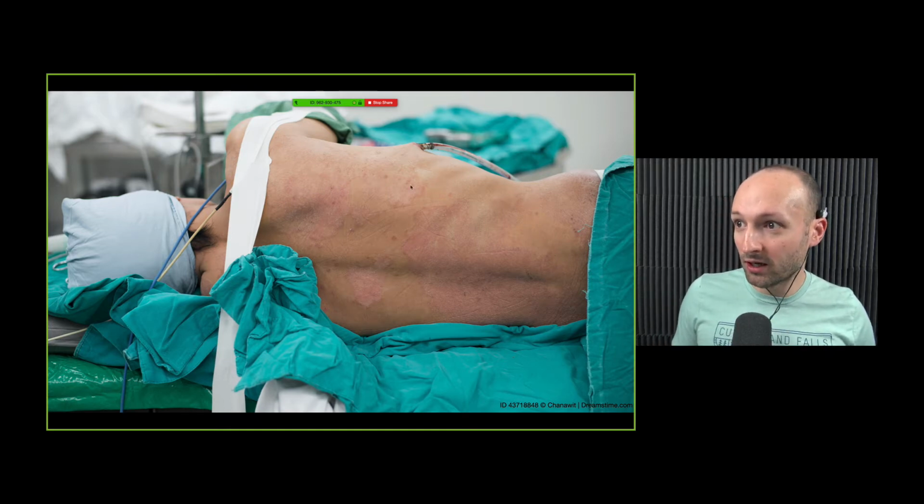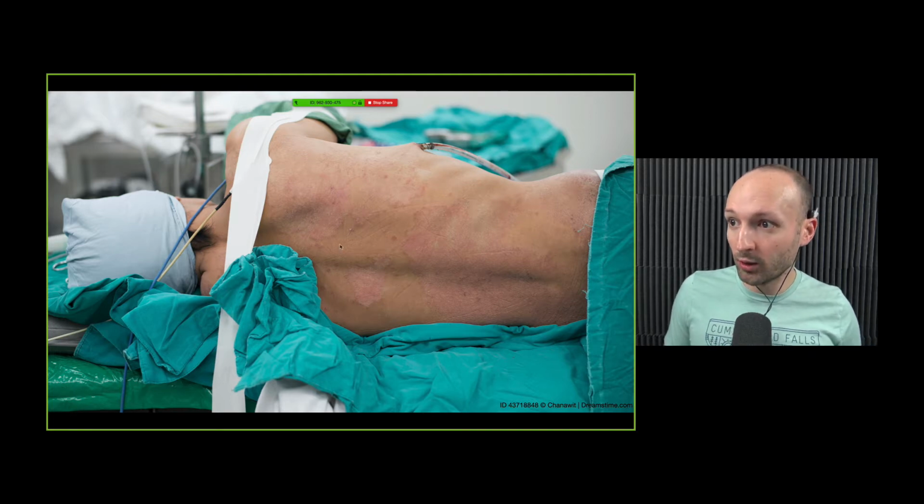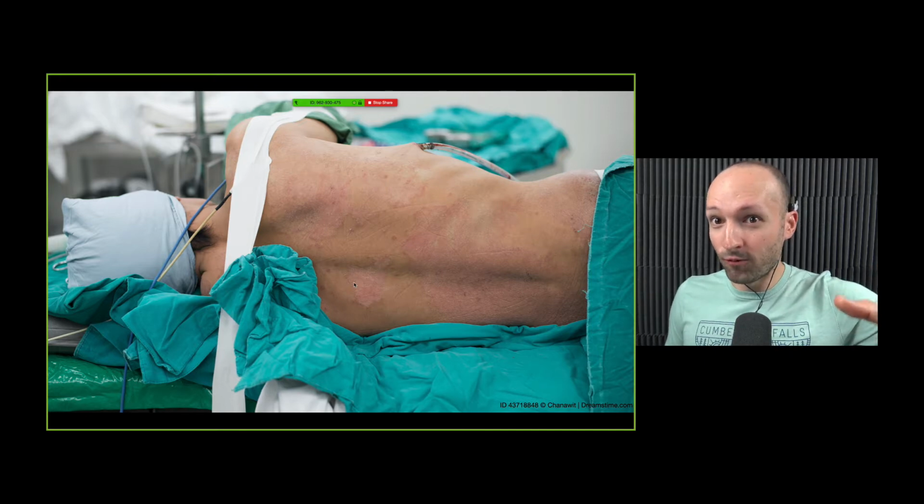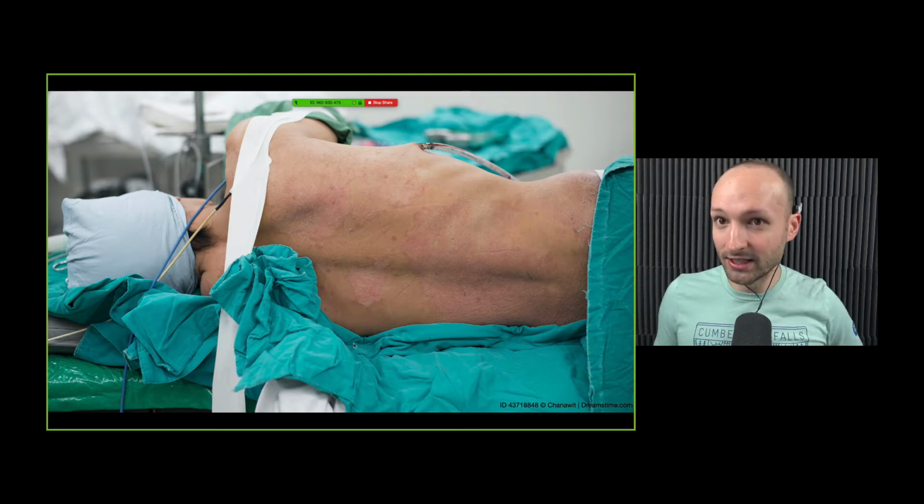Now, if you're looking up here on this side, it'd be a lot easier to look for the whole lower lobe. You're going to have to be a little bit creative with the more dependent side, whichever side that might be. Usually what I do is I have one hand on the shoulder, kind of rock them forward more towards the ventilator, just tilt them down so I can see down here a little bit easier.